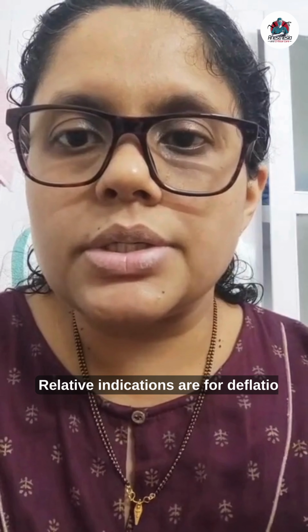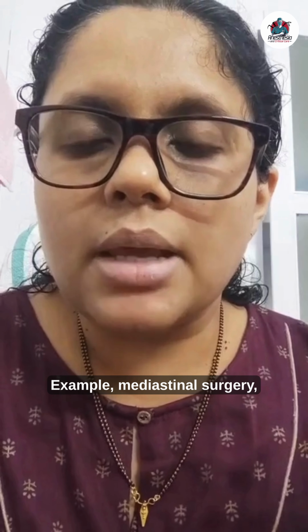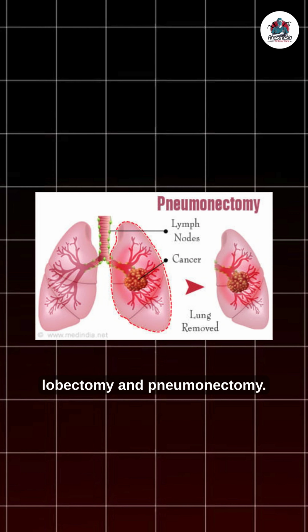Relative indications are for deflation of one lung to provide a motionless field for surgery. Example, mediastinal surgery, esophageal surgery, thoracic aorta surgery, lobectomy and pneumonectomy.